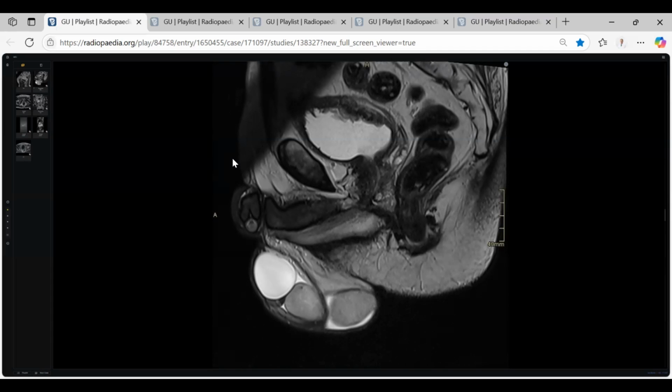Okay, two different tracers are used in PET CT for prostate. For detection of the prostatic metastasis, gallium PSMA. And for prostatic recurrence, choline. I forget the full name, but choline plus something else.